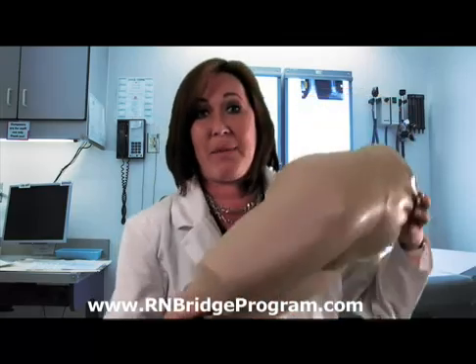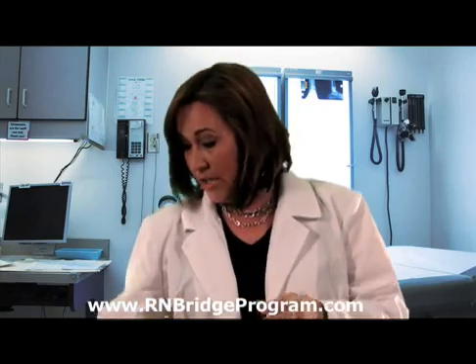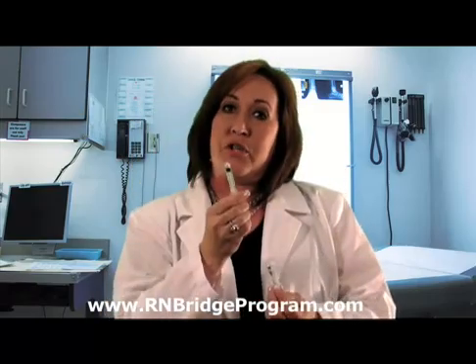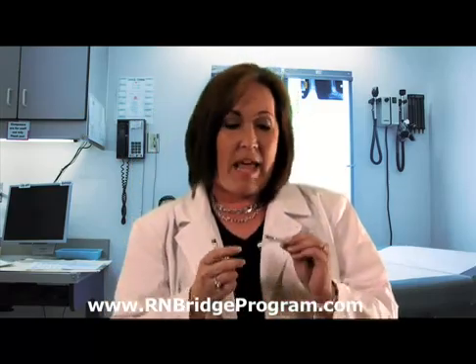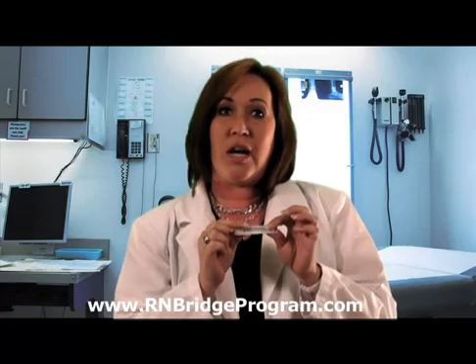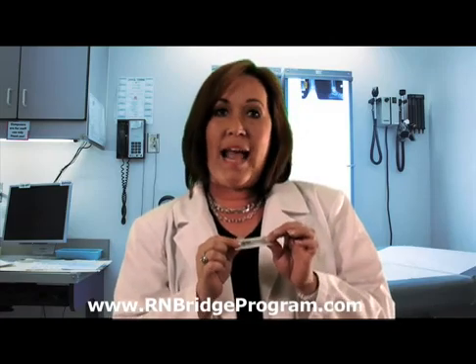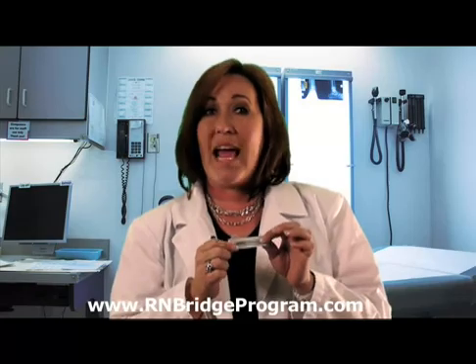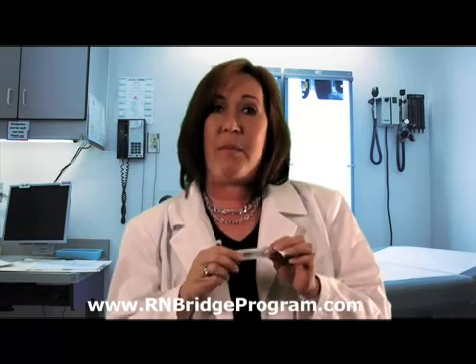Let's talk about some of the supplies you're going to need when getting ready for this procedure. You need a pair of non-sterile gloves — we're not doing a sterile procedure, so non-sterile is absolutely fine. You also need your syringe with your medication, and then a one and a half inch long needle. We use a one and a half inch to get deep into that muscle because it is an intramuscular injection — we don't want to get into the subcutaneous tissue. The one and a half inch is the most appropriate for this site. And then you need your alcohol swab.